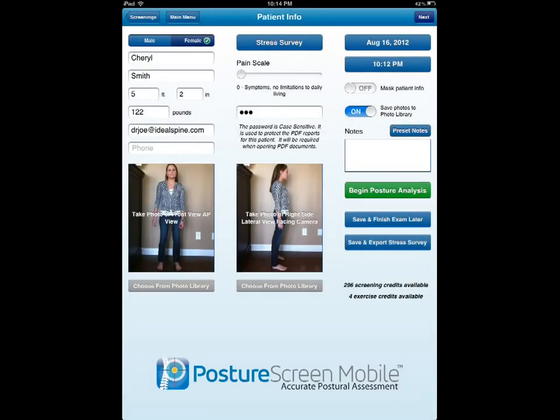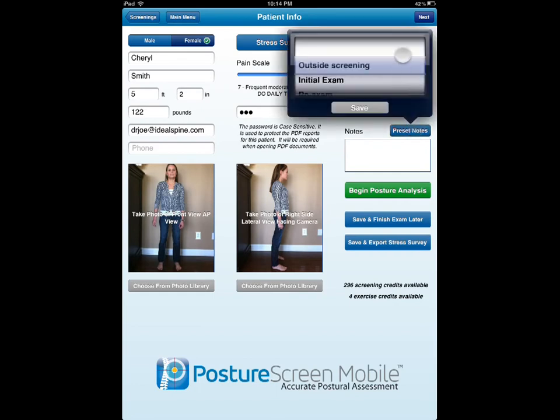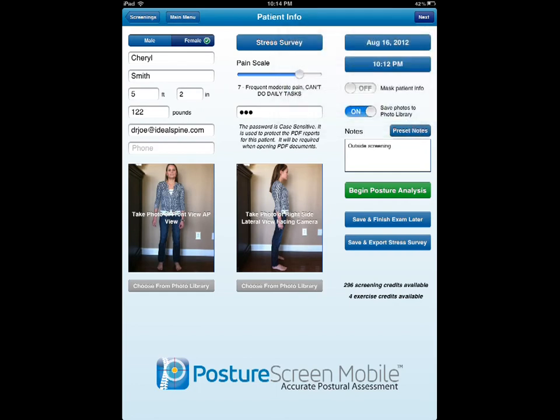Let's go ahead and say their pain is a 7 out of 10, and we're going to label this as an outside screening event. You can also state something in the notes section about this person — their job, their ergonomic situations, whatever it may be.